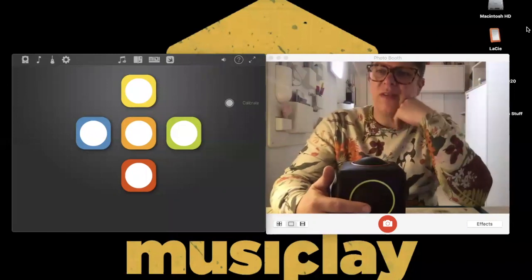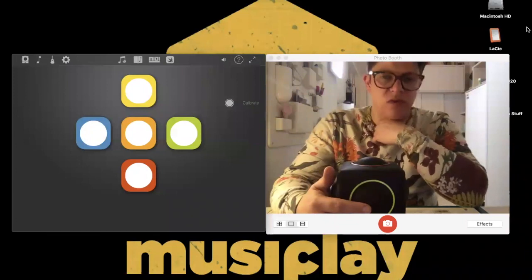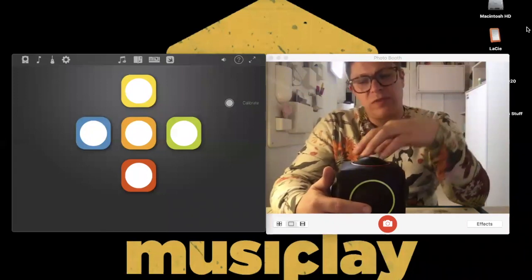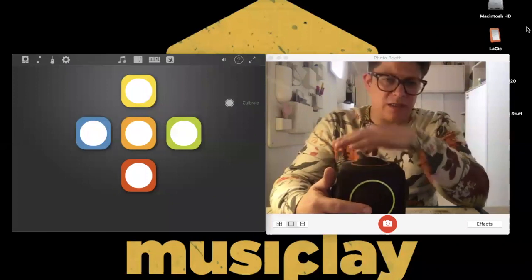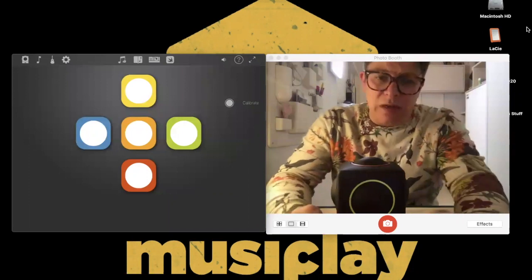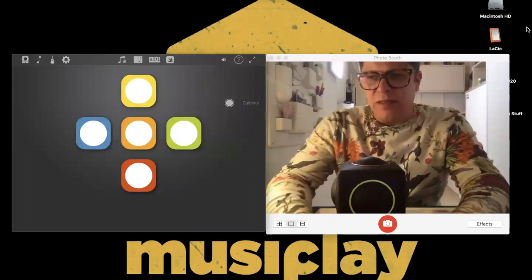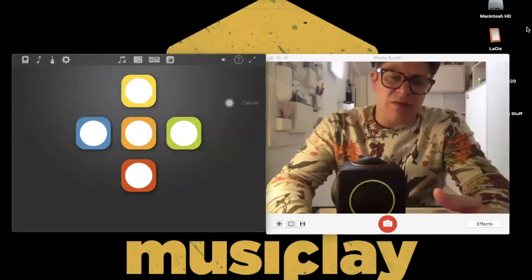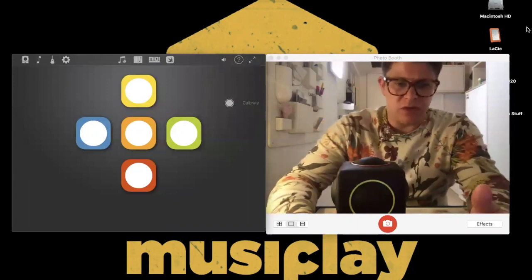And we find that works really well still with children with visual impairments. Also, some people have applied some stickers here and there, but I would say it's worth giving the new Skoog a go, because the really strong relationship is between the sound and the touch. And obviously, if that's augmented with color, that can be really, really useful.